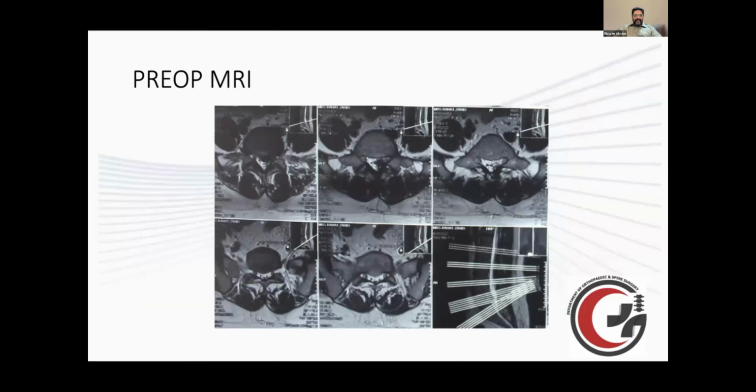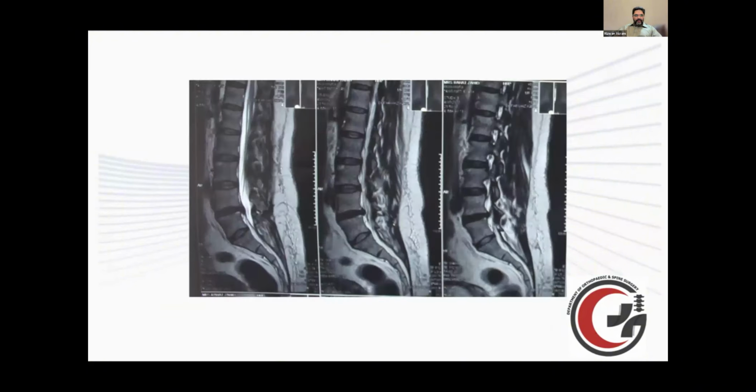Yeah, I think this patient had a sacralized L5 with large transverse processes, and there was minimal movement at L5-S1. So the major segment which she was bearing weight on was L4-5. So I think that could be one reason for having a residual disc and this disc disease at this level. This is one adding point to it, if you see the X-rays.